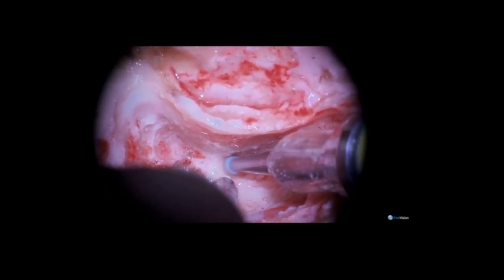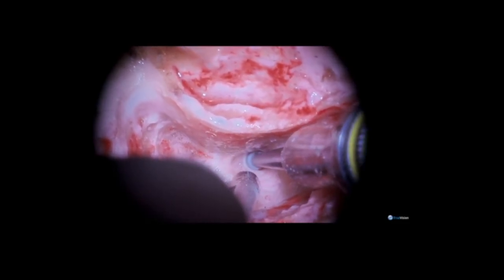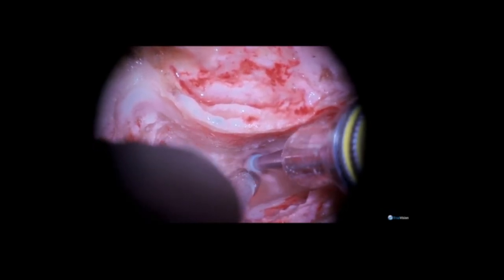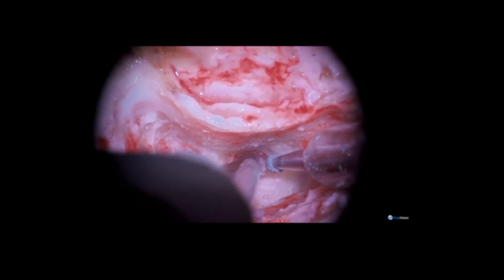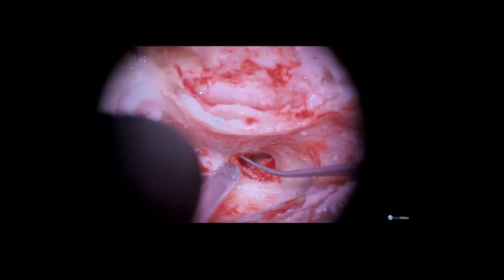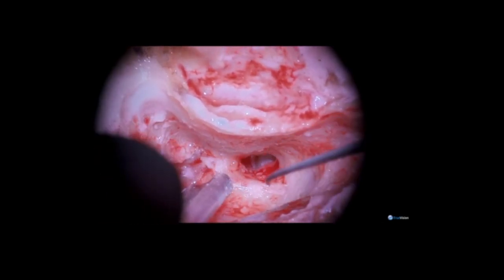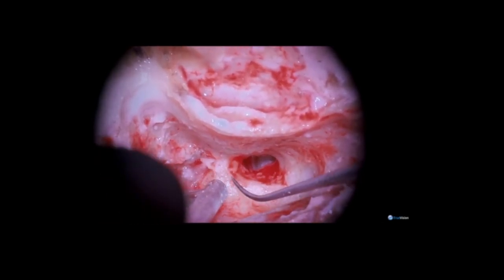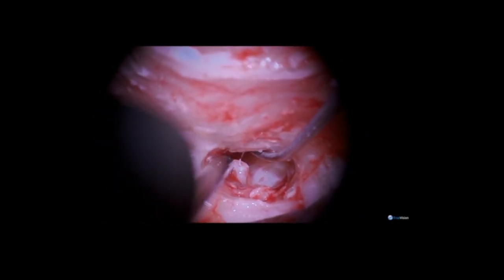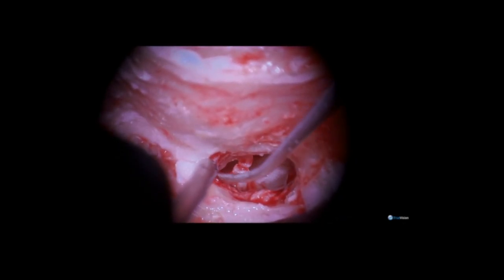Now I am going to enter the posterior tympanotomy and disarticulate the remainder of the incudostapedial joint. This will minimize any acoustic trauma from drilling onto any remnant of the incus.